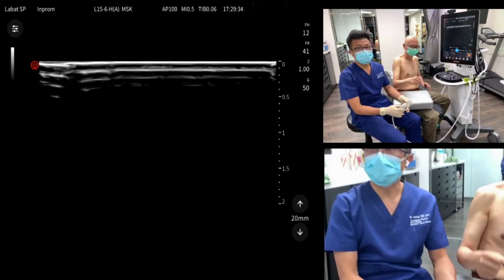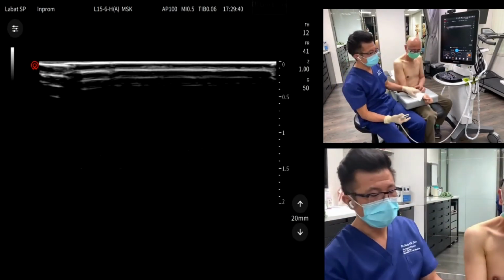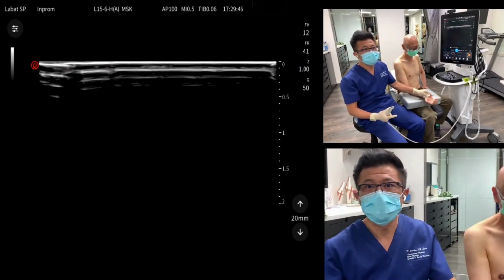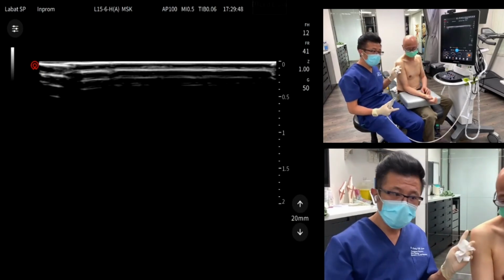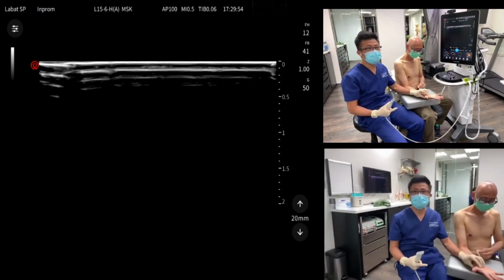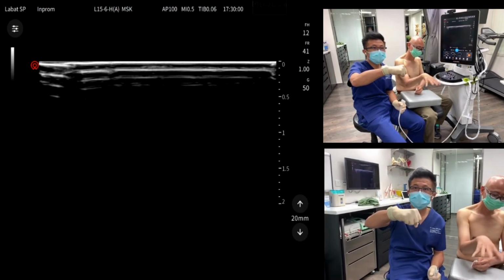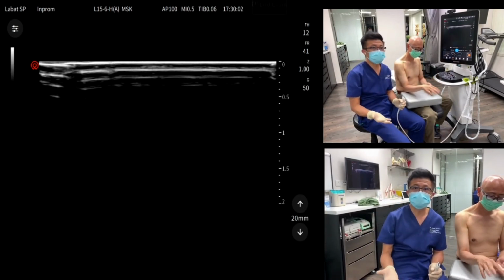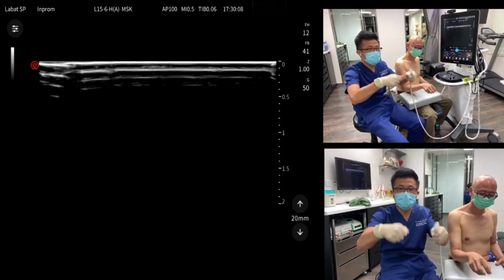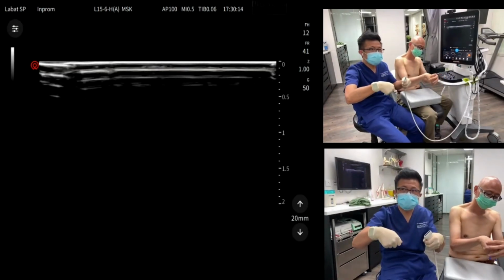Okay, I think that's enough for a short demonstration how you can utilize this machine and then to do a dynamic ultrasound to make a diagnosis of musculoskeletal problems or neuromuscular problems. So if Robin is presenting with like a thenar muscle weakness, and at the same time when he's doing this squeeze, then I'm going to ask the next question is whether you are squeezing, holding the fist, or having some repetitive movement, holding something, and with elbow with the wrist flexed or extended.